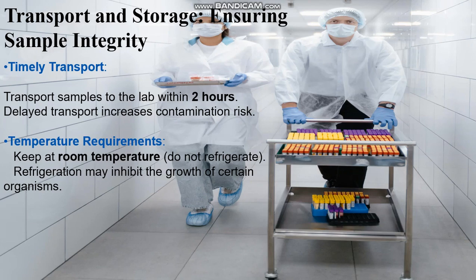The temperature of the sample is equally important. Always keep blood culture bottles at room temperature and do not refrigerate them. The reason for that is that refrigeration can inhibit the growth of some organisms, potentially leading to false negatives.